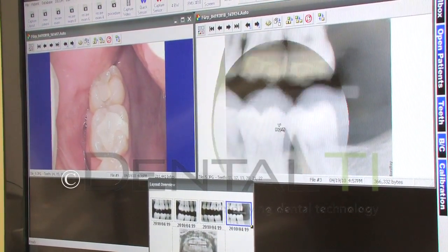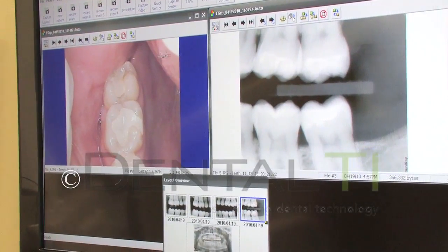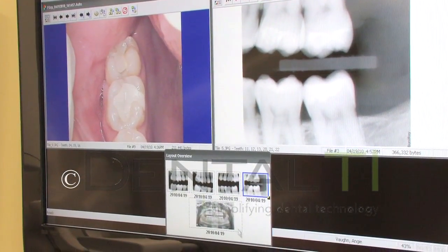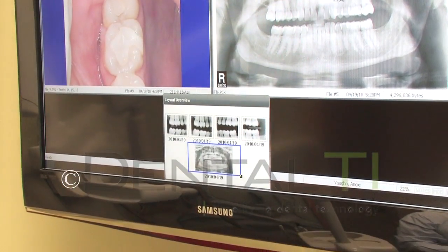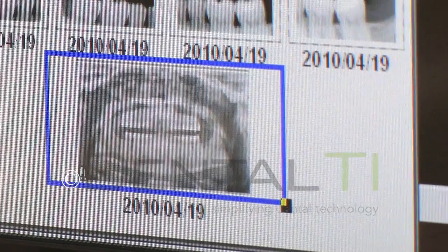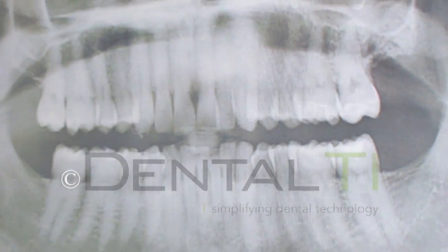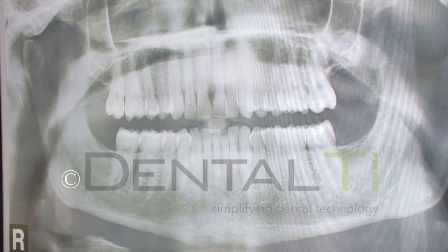Here we can show the patient an x-ray and a camera image side by side very easily. We can click on the pano, the pano comes up, and it's very easy to bring it up in full screen so you can focus on just the pano to review with the patient.